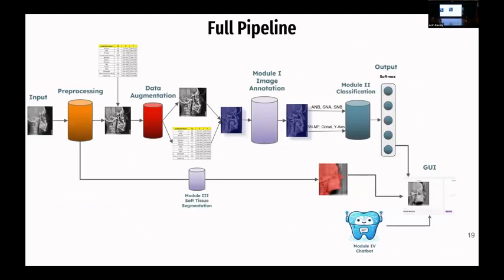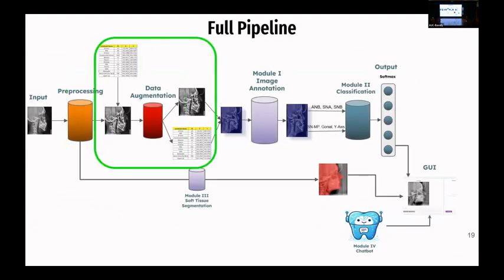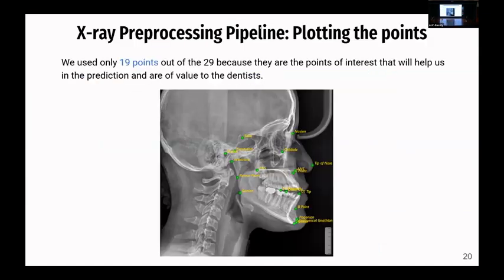And now we are going to move to the next step, which is the data augmentation that's going to be presented by Islam. Moving on to the second step in the pre-processing, we have to first collect and annotate the landmarks.